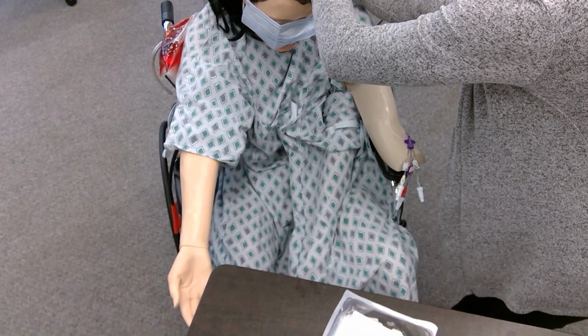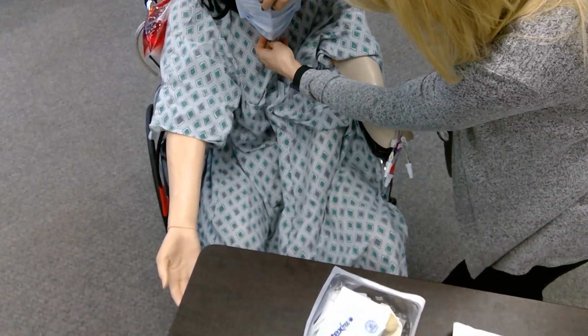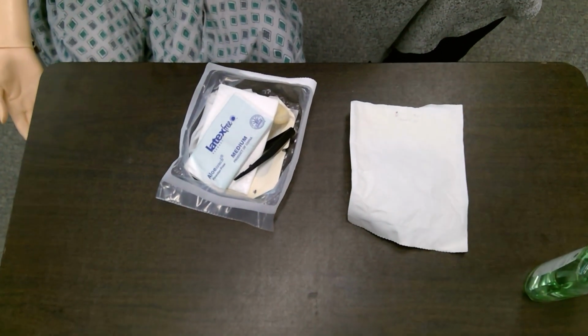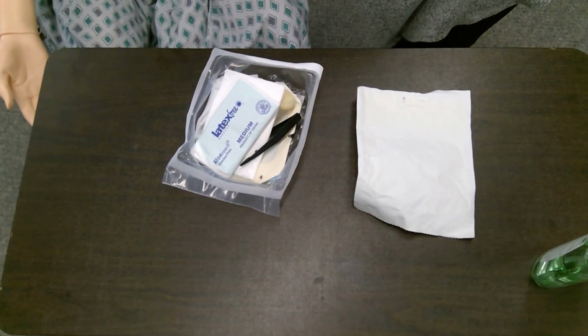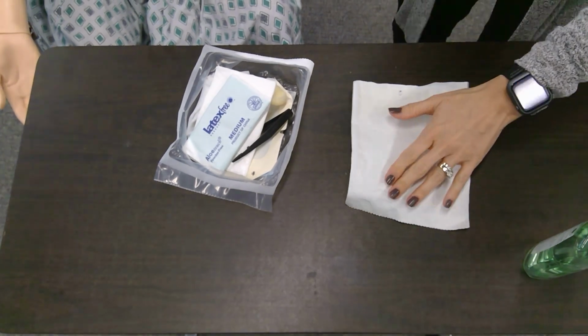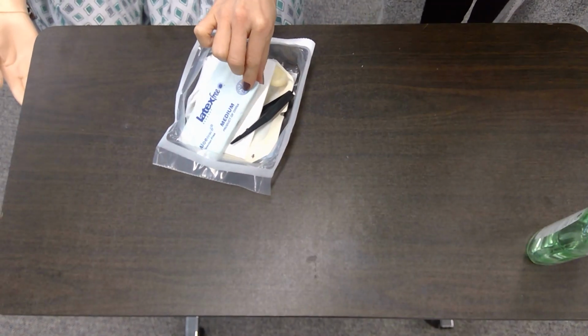If the patient's unable to wear a mask, you do need to have them turn their head to the other side so that they don't get any germs on the insertion site while you have this dressing off. Okay, Sarah, is that okay? It's fine. Okay, I'm going to go ahead and get my sterile gloves out.